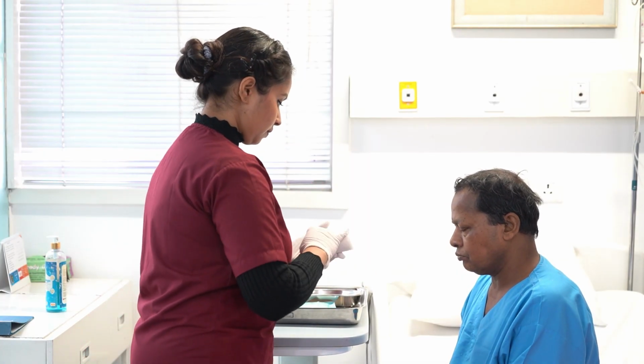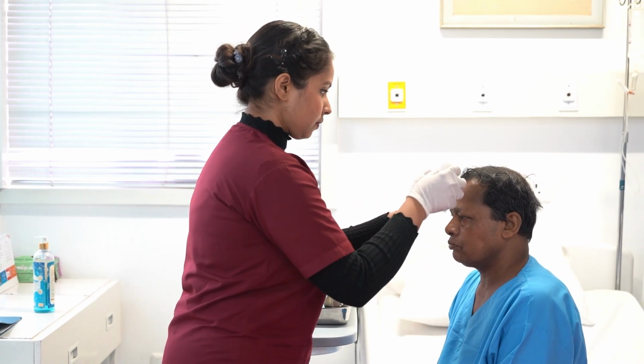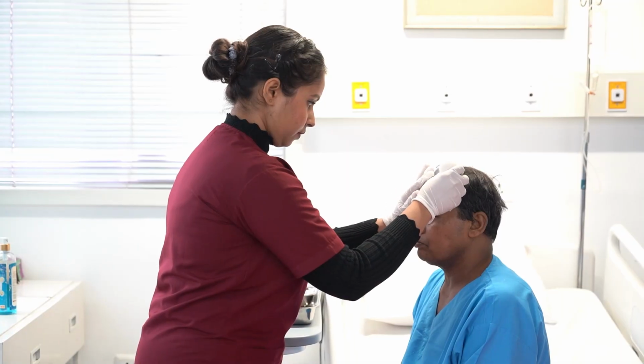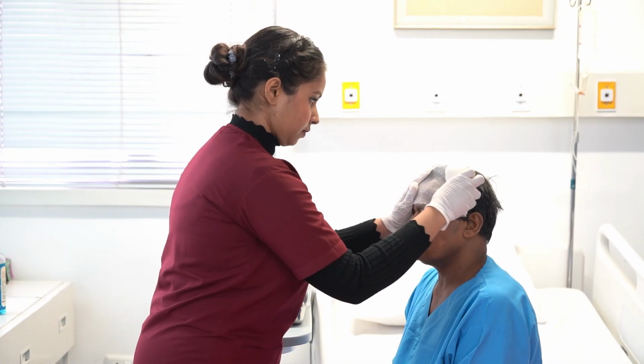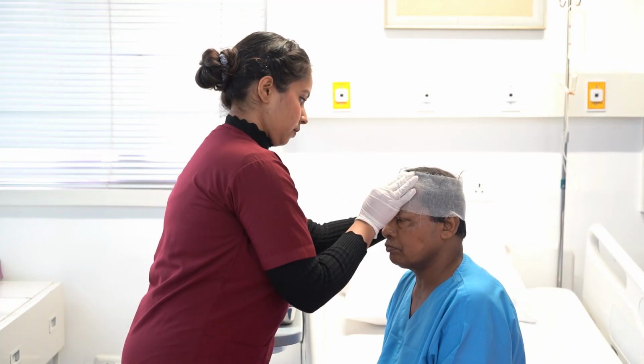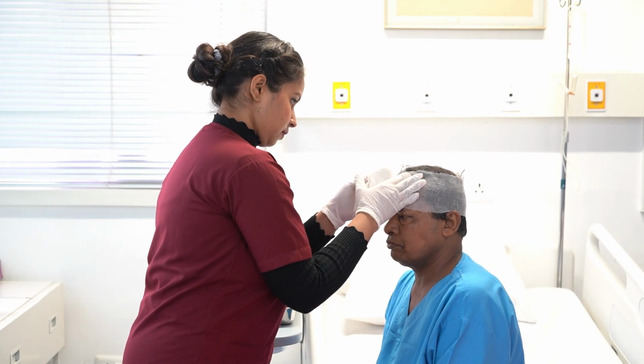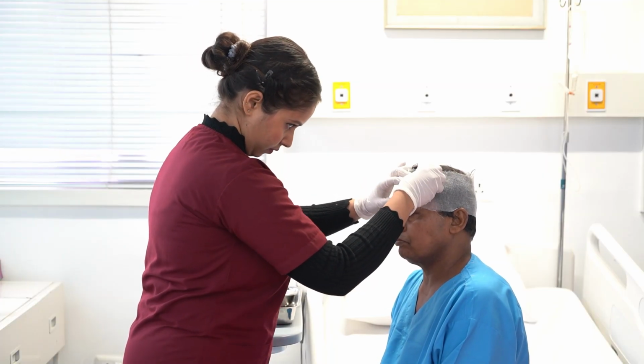Support the injured area while bandaging. Face the patient while applying the bandage. Always apply the bandage from inner to outer and far to near end. Make 2 circular turns to anchor the bandage.